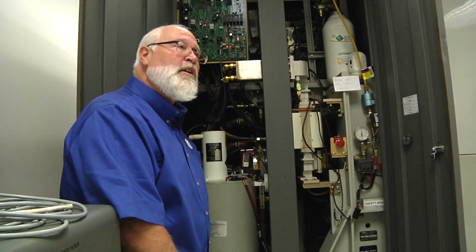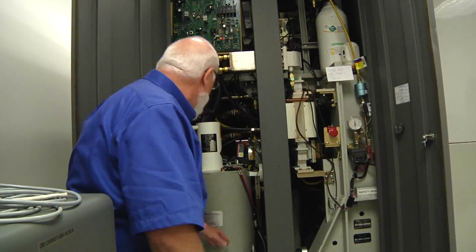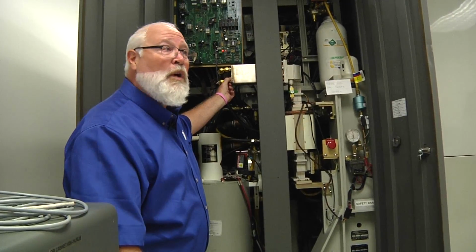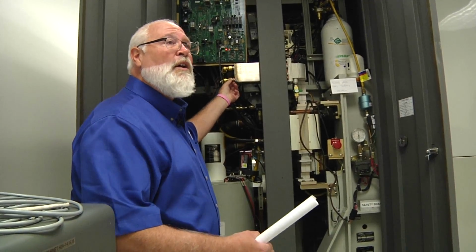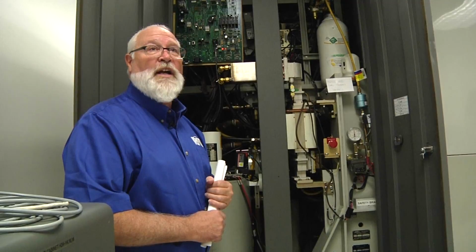So you always want to tell your engineer about any oil leaks or any water leaks on any of these fittings, any drip, discoloration. If it's copper and there's water, it'll turn green. So those are all things you need to look at as you're getting information for your morning check.